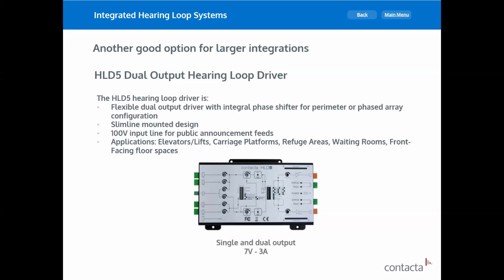So it's a single or a dual output. It delivers 7 volts and 3 amps. And everything's adjustable here.